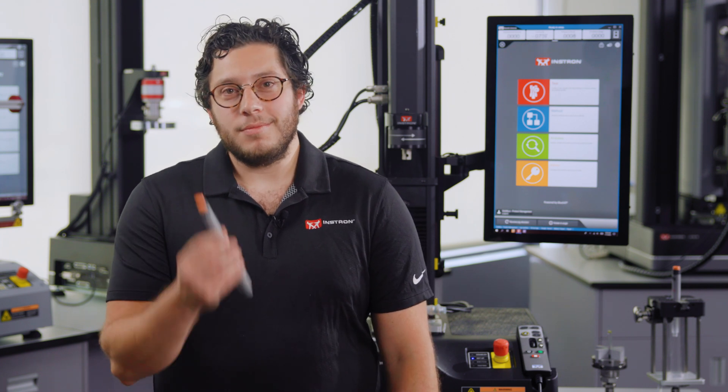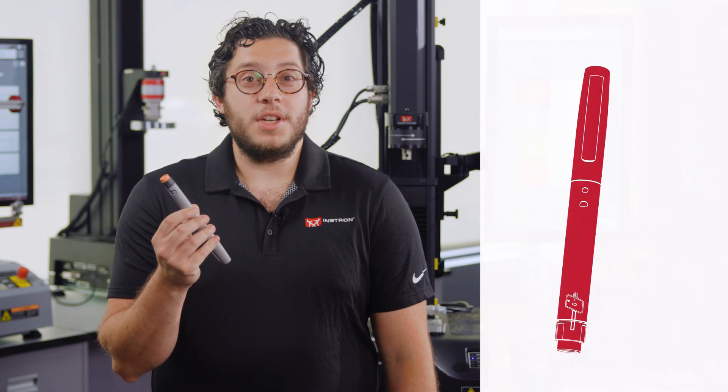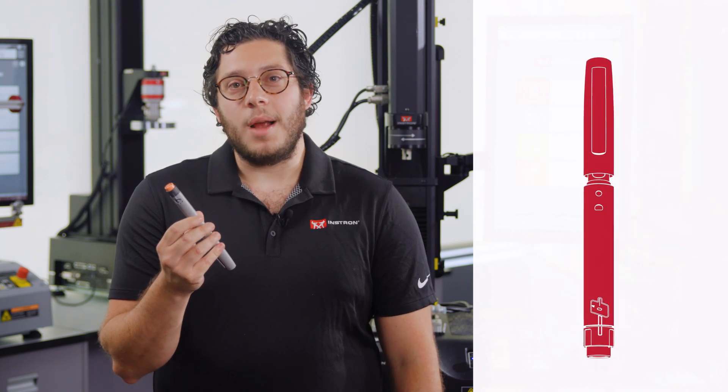To start, we're going to take a look at the device that has been most associated with diabetes treatment in the last 20 years: the insulin pen. Despite their improved usability compared to a traditional syringe and vial, they are internally complex devices that require significant testing to ensure they function properly.